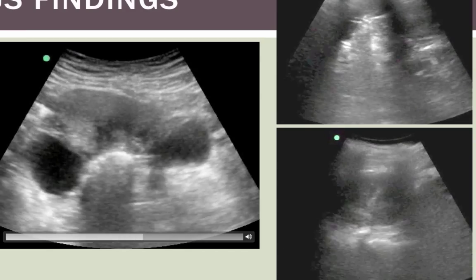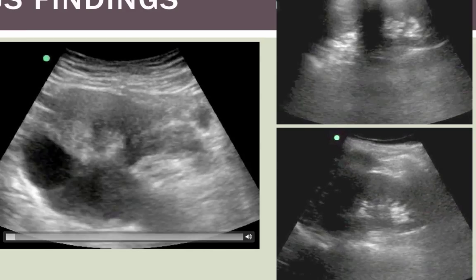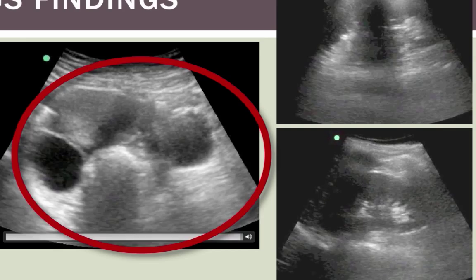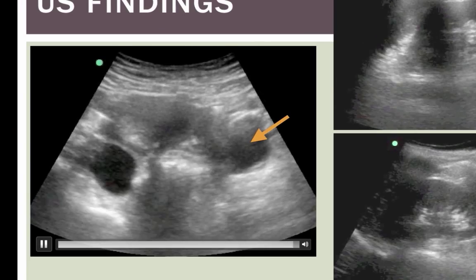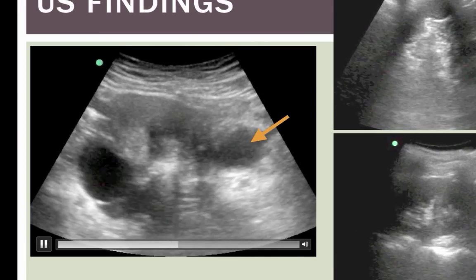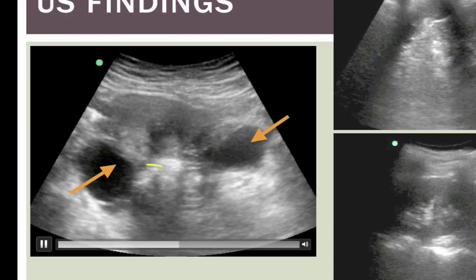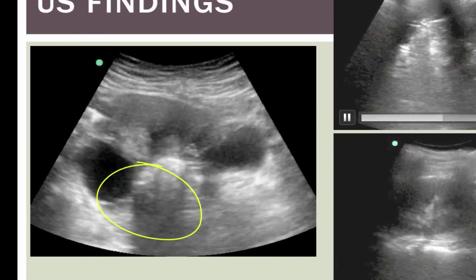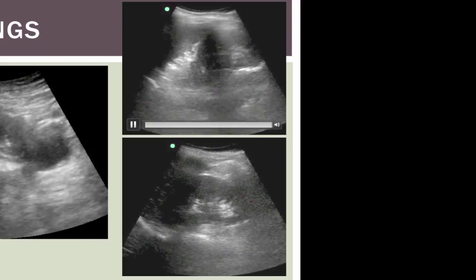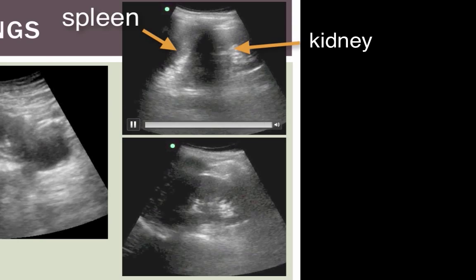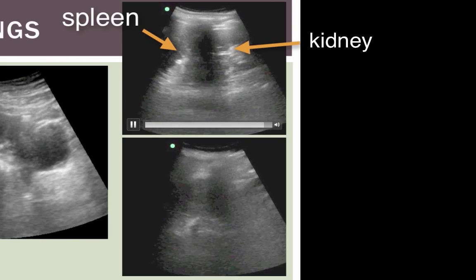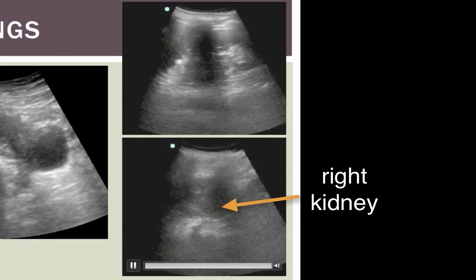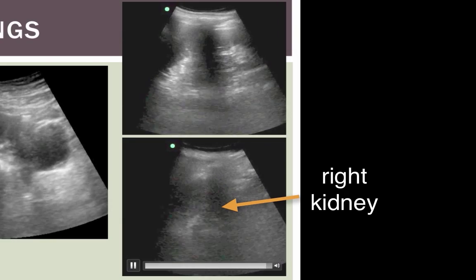Some of you probably have already caught on to these pictures being a little bit different. Here's our transabdominal view of the uterus. We've got what looks like some kind of cyst over here, cyst over here, maybe something going on here - a mass or cyst. Looking up in the rest of the abdomen, this is the spleen in the left kidney. We don't see any free fluid up here, and this is the right kidney in Morrison's, and I don't see any obvious free fluid.